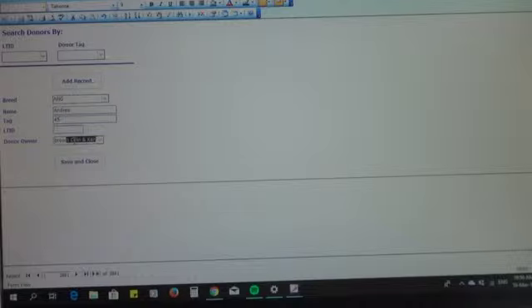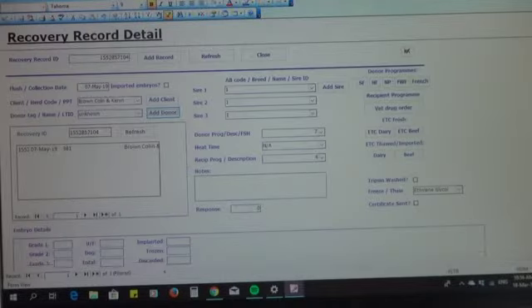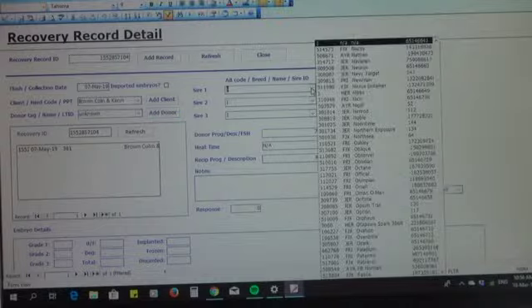Particularly the owner can be a lot more connected to his sheet. Occasionally we do work on farms, so we might be at Colin's farm, but we're flushing a cow that belongs to someone else. That does happen. Okay, so now we have sire.